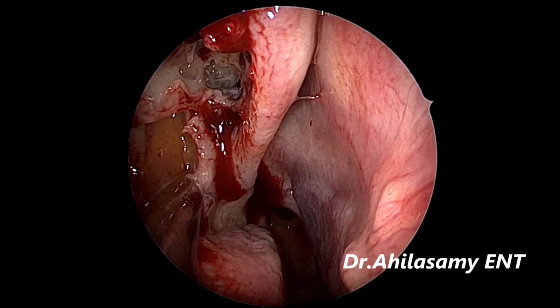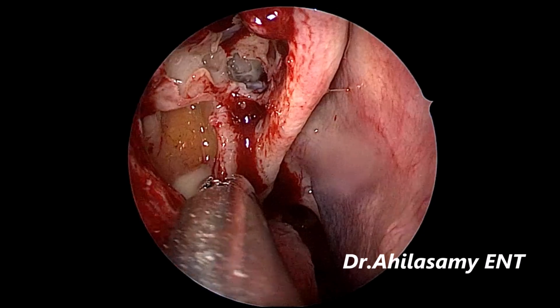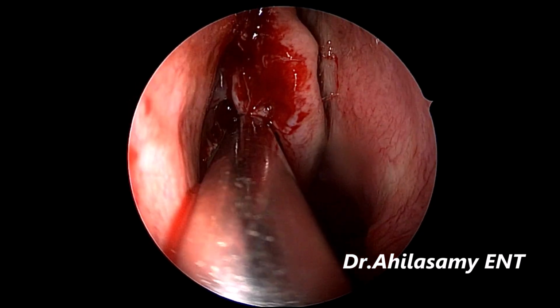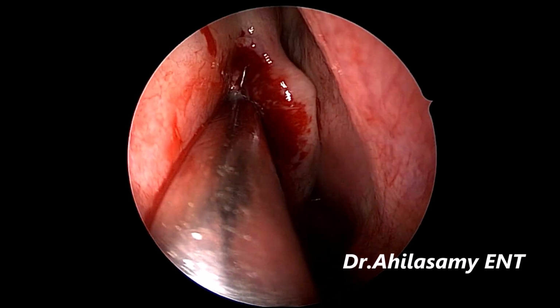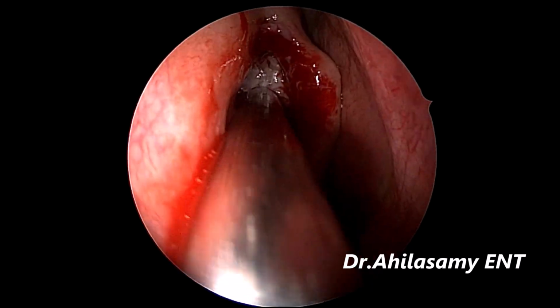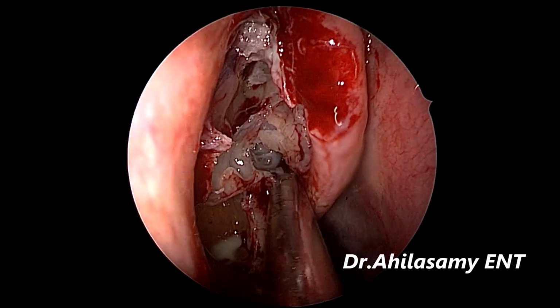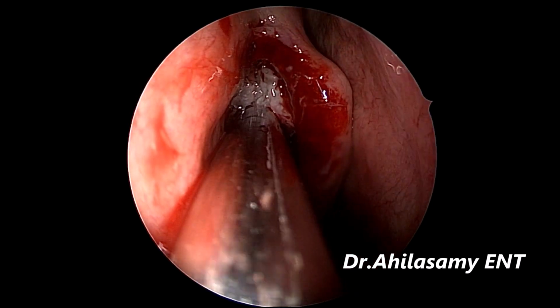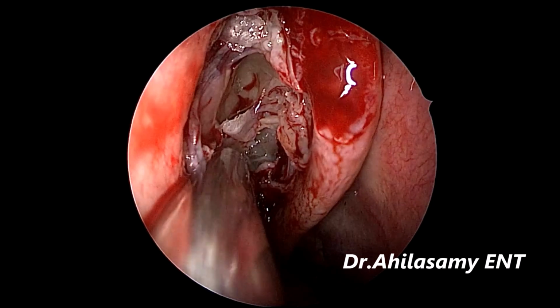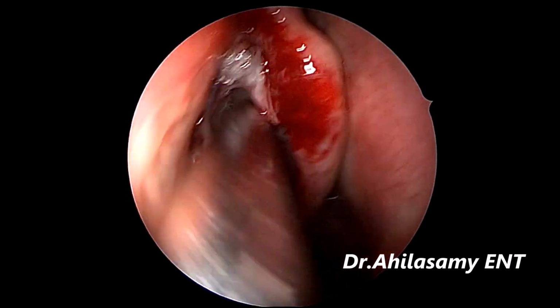So we have gotten very good MMA. The posterior edge of the MMA is being taken out to make it a very wide MMA. Now I am doing the ethmoidectomy with the shaver itself, or the microdebrider. Then appreciate the lamina papyracea on the lateral.